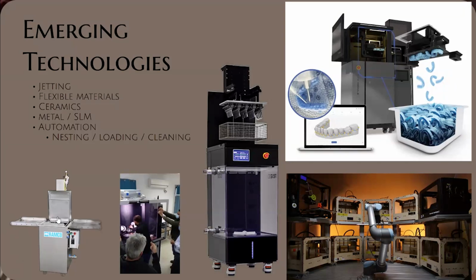I've already mentioned the jetted technology. I do think that's up and coming. We're going to see that more and more. We're going to see more and more ceramic loading in these resins. They're all out there now. We have some, and they're all around 50, 55% maybe. So you can call them a ceramic restoration, but it's still 49% plastic. And I see that will change. And eventually somebody's going to figure out printing zirconia. There's one out there that's doing it, but it's not ideal right now.